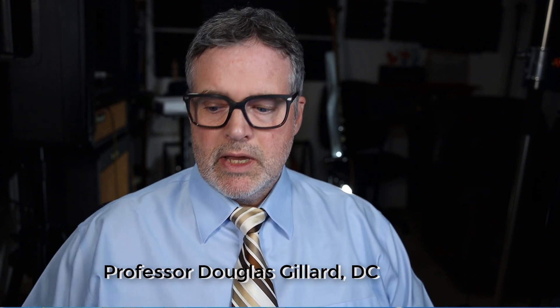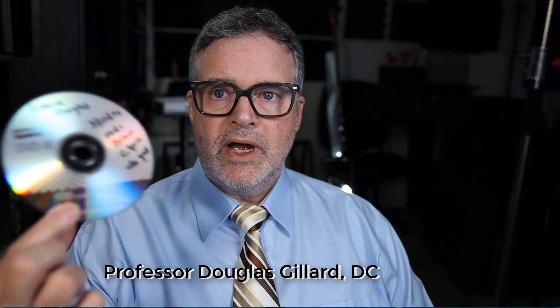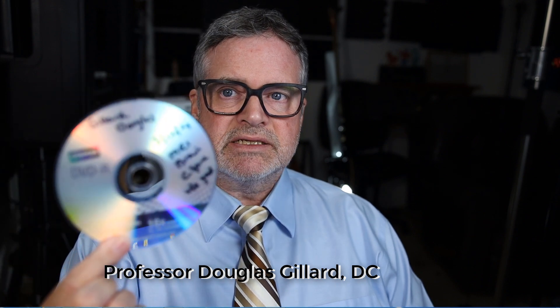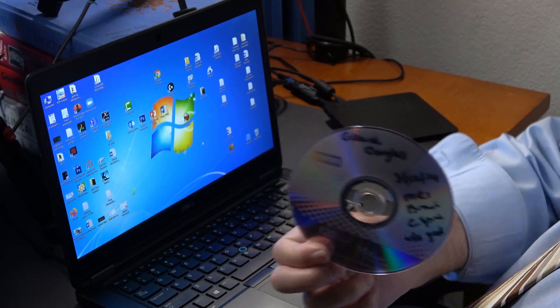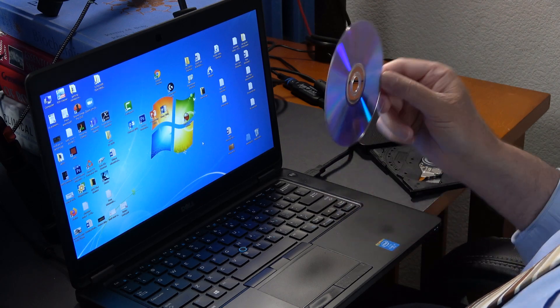Hi guys. To reinforce what we just learned in the 'How to Read Your Cervical MRI' video, let me show you how to read my latest cervical MRI disc that I got from Good Samaritan Hospital not too long ago. I've got double cameras going here — actually three cameras — including a screen capture.